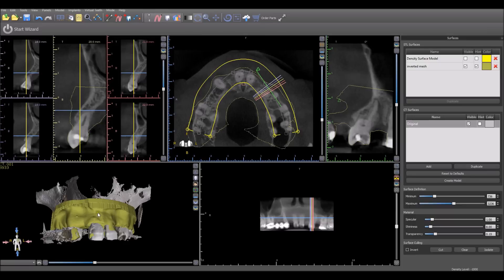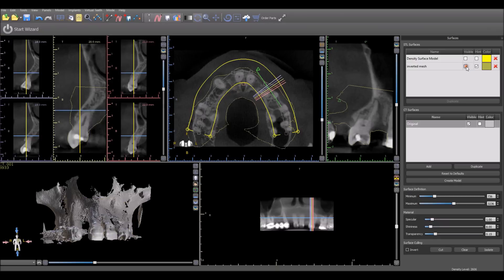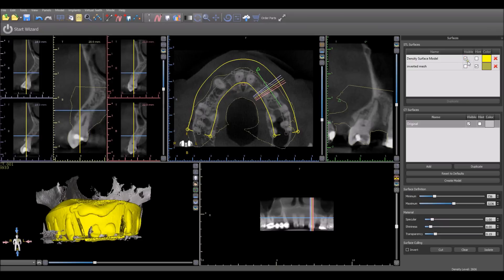We now have the imported inverted impression appearing in our surfaces panel, and we also have the actual impression as well.